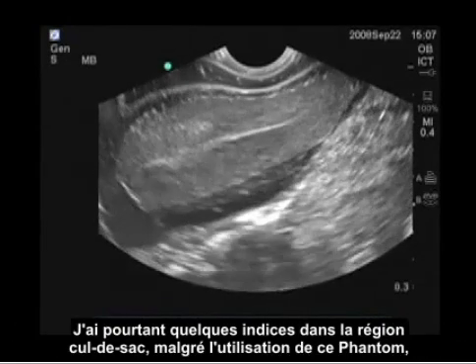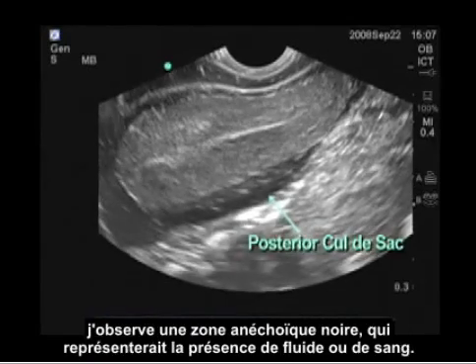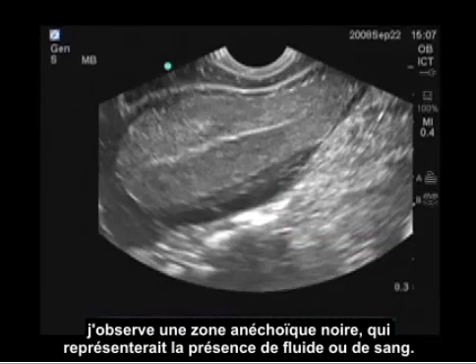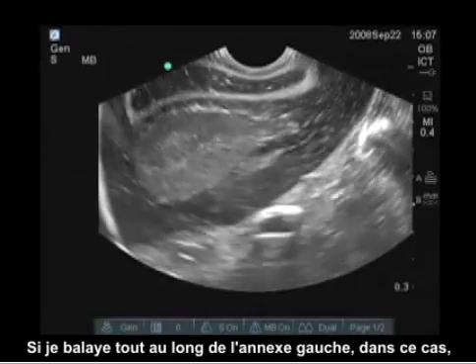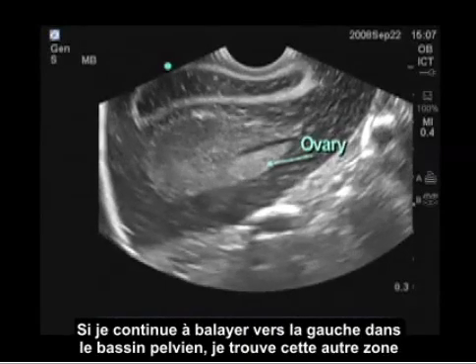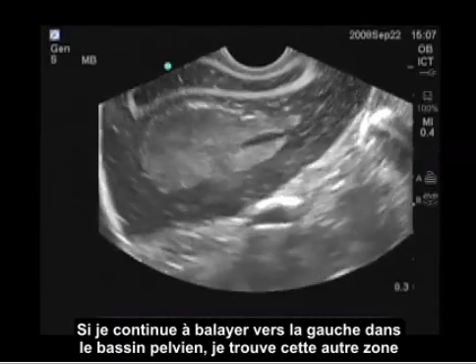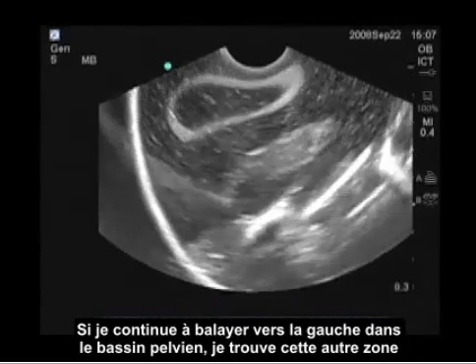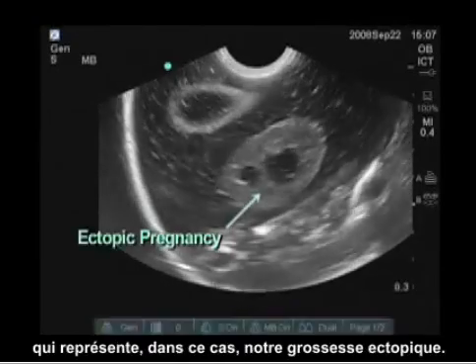There are some hints using this phantom. In the posterior cul-de-sac region, I'm seeing a black anechoic area which represents free fluid or blood. Scanning all the way over to the left adnexa, the first structure I come across — this echogenic area — represents the ovary. Continuing to scan left in the pelvis, I encounter another area, which in this case represents our ectopic pregnancy.